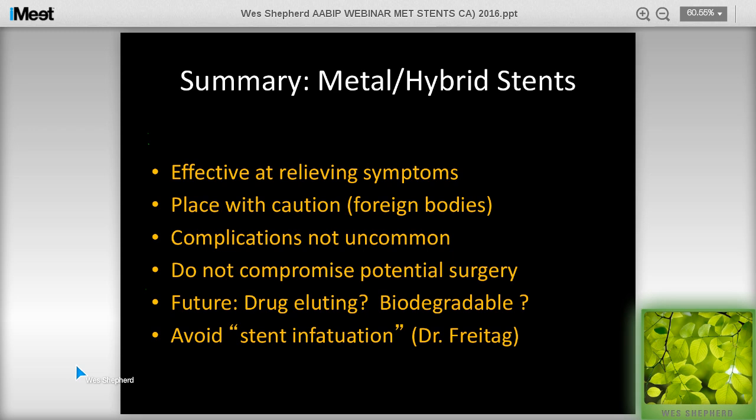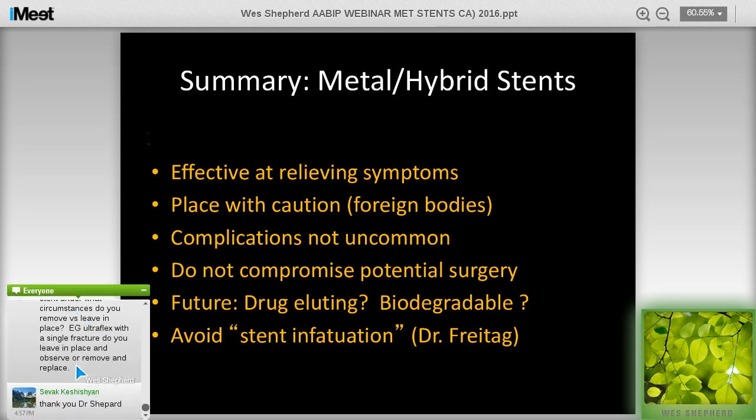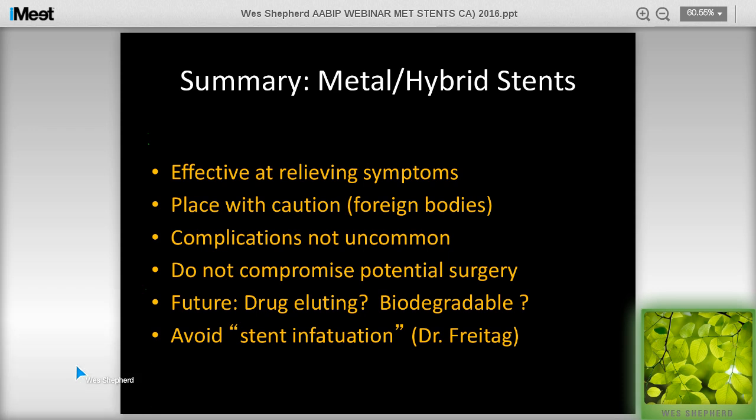So I don't think there's a right answer. I think it may depend on other clinical features of your patient, or how sick are they? Are you doing the procedure because they have respiratory failure and they're on a ventilator? But it's a tough question to give a definitive answer for, except we'd like to see at least more than 1 or 2 segments or subsegments.